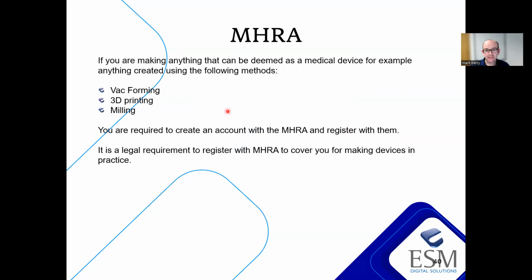I think the one last thing we need to cover, it's kind of like the elephant in the room, is MHRA. If you're making anything in-house, it's going to go in a patient's mouth. It's regarded as a medical device. It's a customized medical device, specific to that particular patient, so the registration is a little bit easier. And that's even if you're currently vacuum forming, taking printing out of the equation. If you're vacuum forming on stone models, making a retainer, you need to be MHRA registered. So it's definitely important.